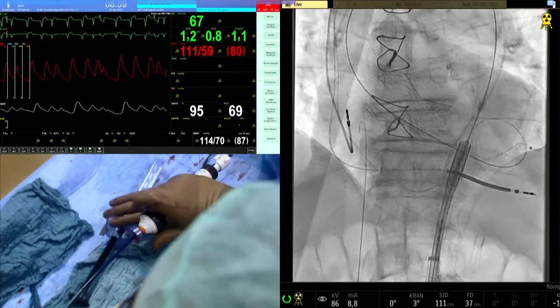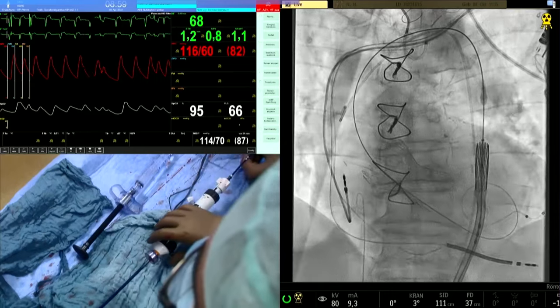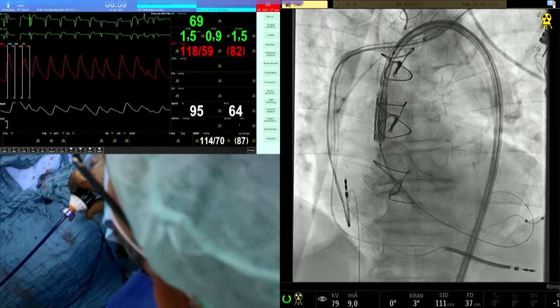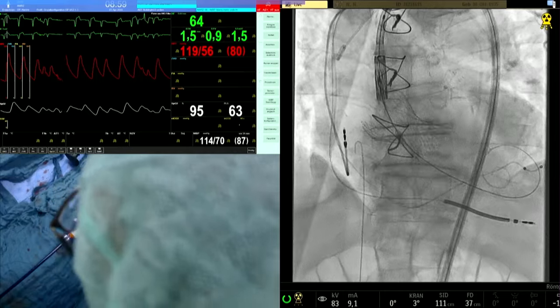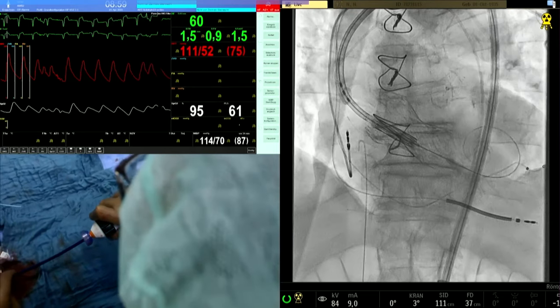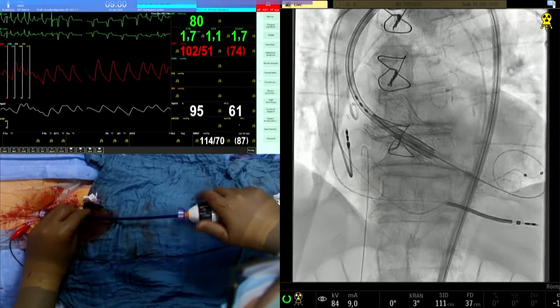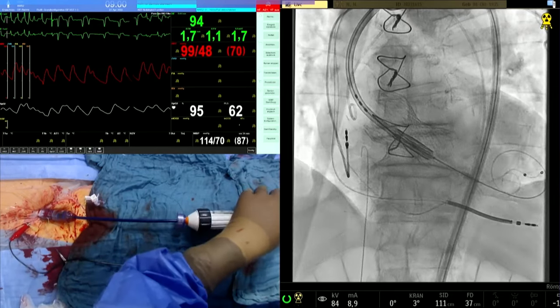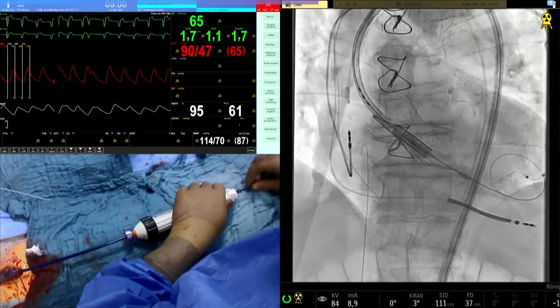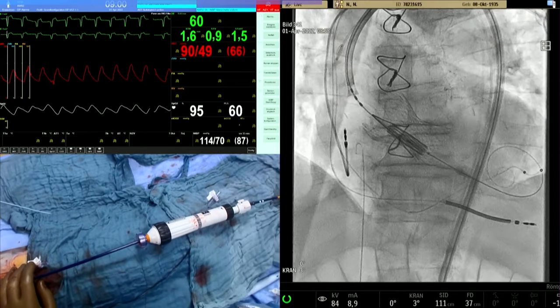Okay, so the usual loading of the device. We'll pay some attention now while crossing the arch. You can see here the Sentinel device. Not really crossing until here is good. And then Philip is helping me now to get away from the valve frame. Now we have some resistance crossing the leaflets, probably. So now we crossed with a little bit of push. Then we need to pay attention now a little bit to the hemodynamics. We're going to get the pusher up. And then maybe we magnify a little bit, Philip. Yeah.